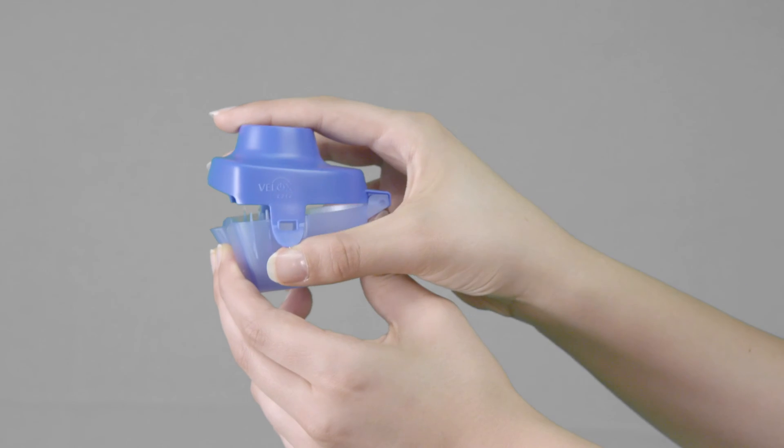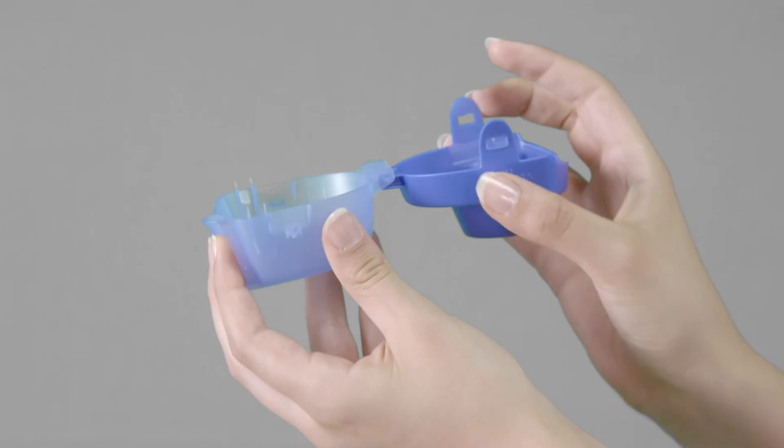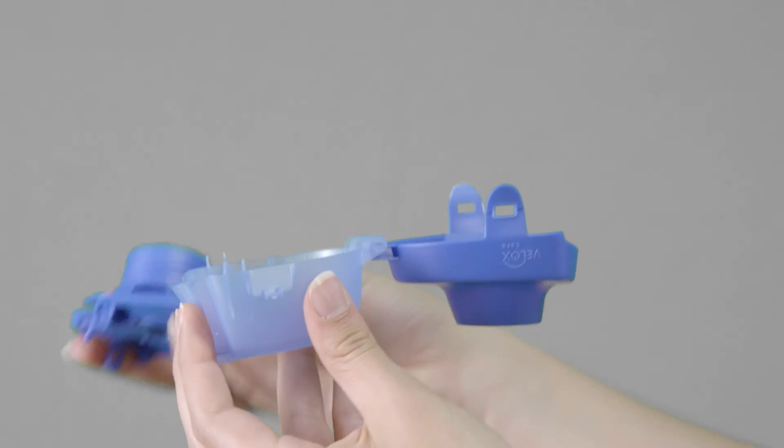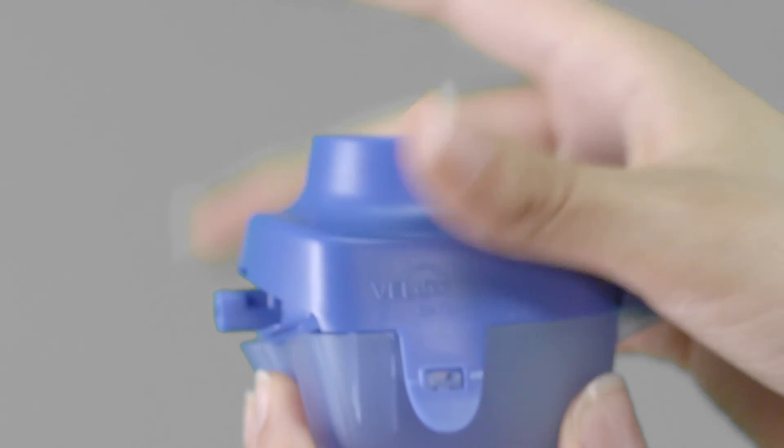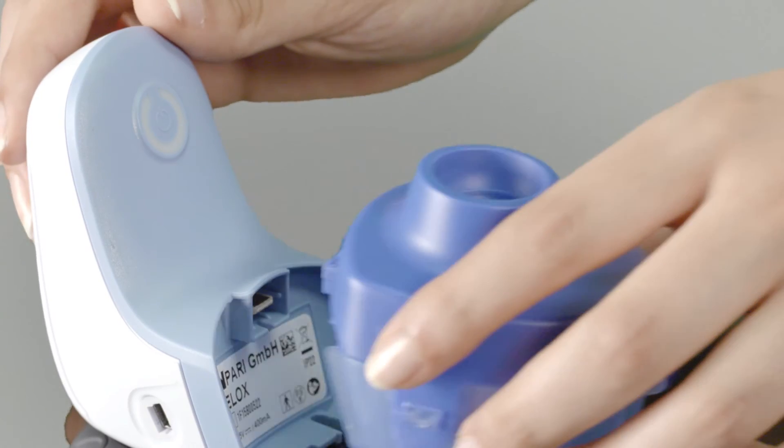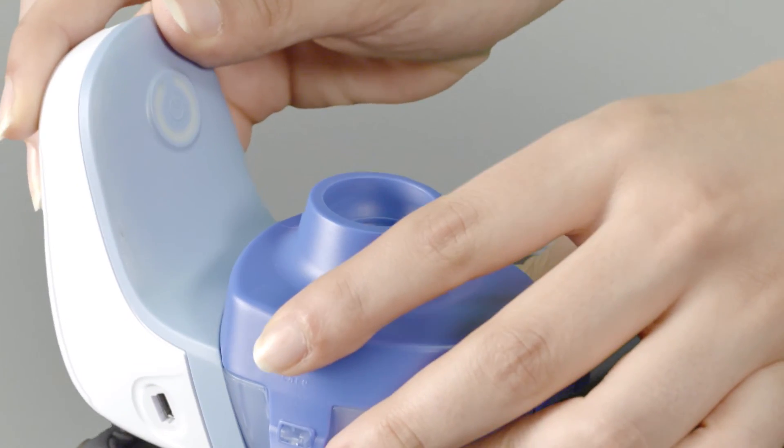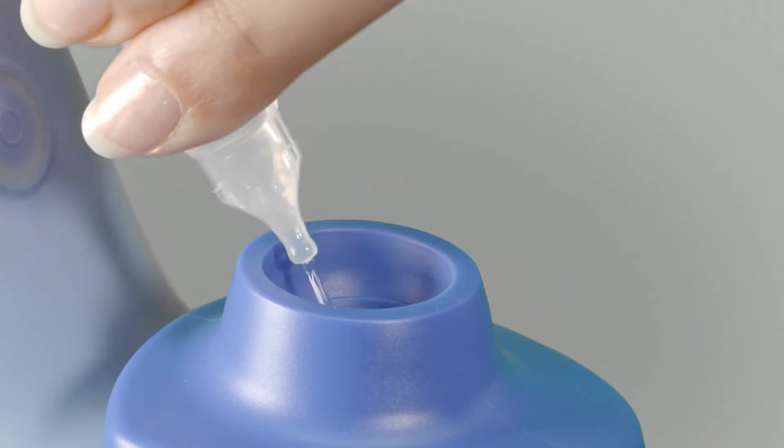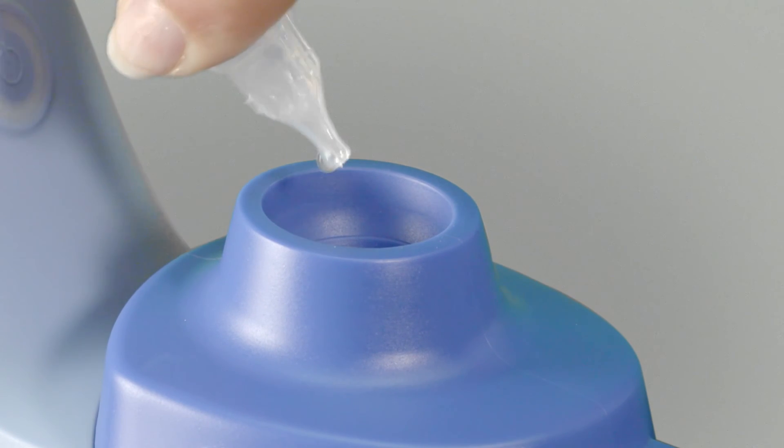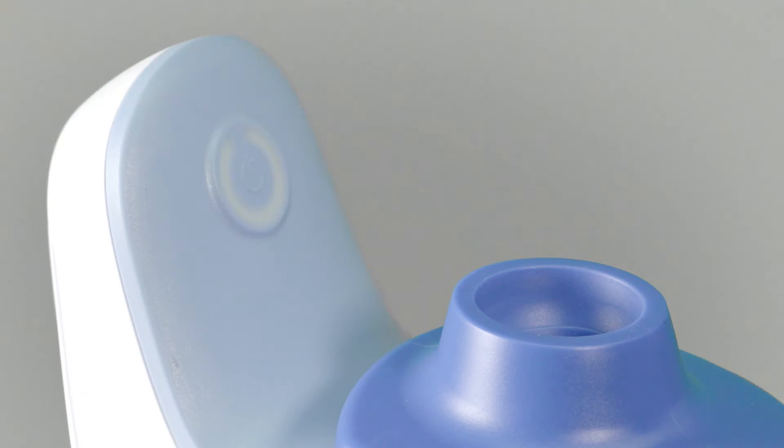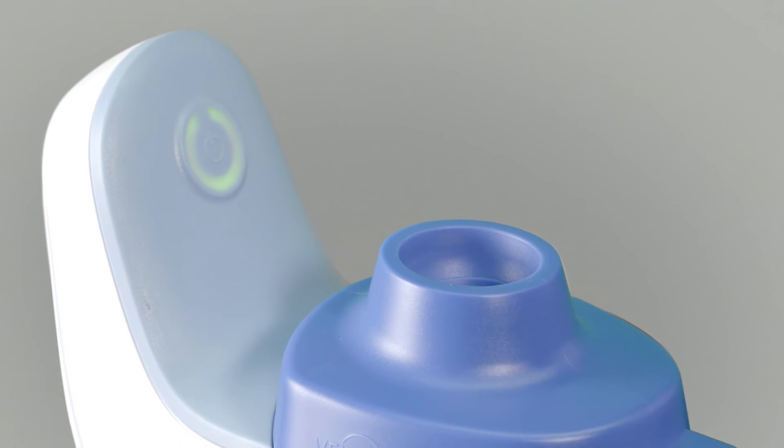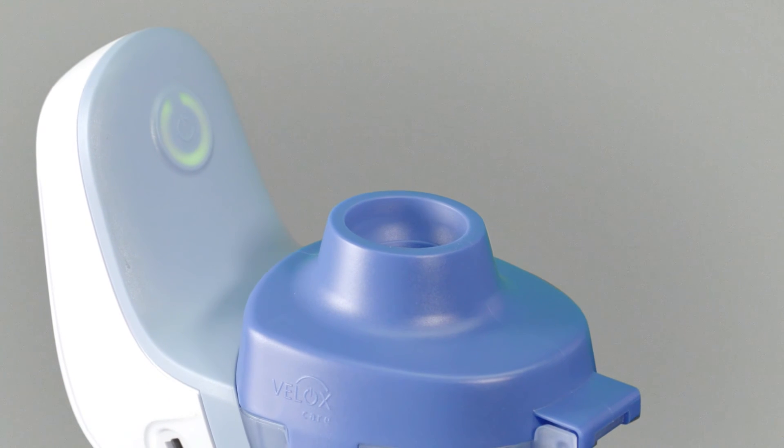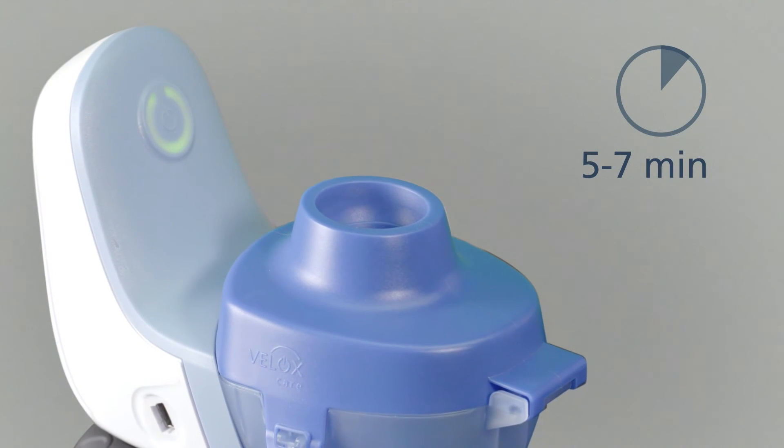Velox Care helps you keep the membrane inside your nebulizer clear. It is a simple way to clear out the pores in the membrane. Insert the medication reservoir with the aerosol head upside down into Velox Care and connect to the controller. Pour in distilled water or a saline solution and switch it on. The solution used will be pushed through the membrane, clearing it out as it goes. This process takes around 5 to 7 minutes.